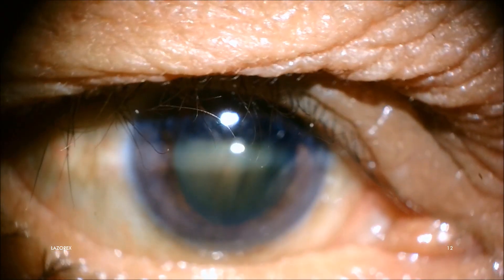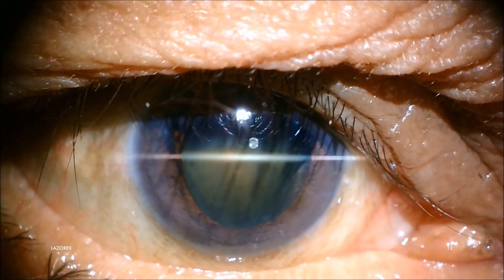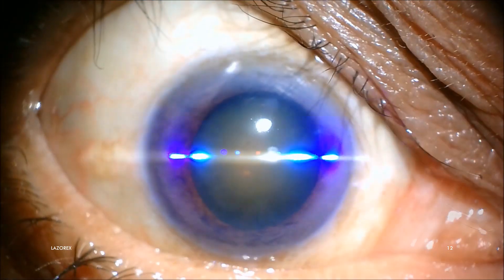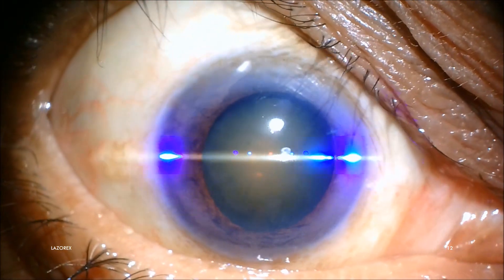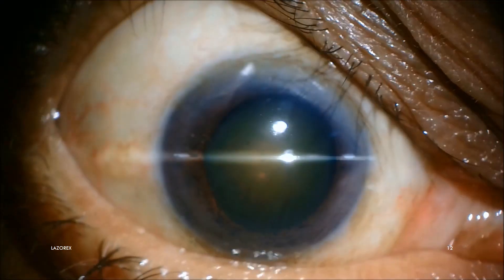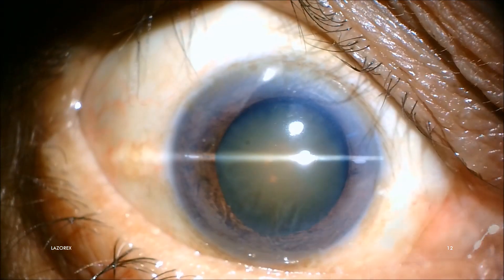After bringing the horizontal slit to the corneal center such that it passes through or just under the red dot Purkinje image, the laser shot is fired and two marks are done on the cornea in microseconds.